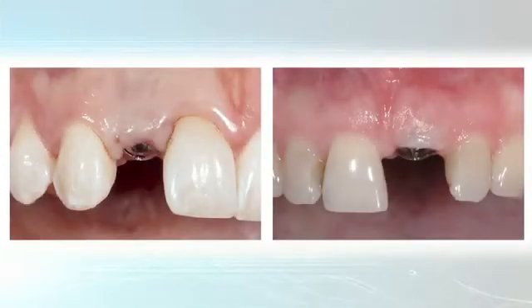But in many cases where a tooth was taken out and implant placement delayed, or for example a congenitally missing tooth where orthodontics opened up a space and now the surgeon placed the implant, covered it back up most likely, performs perhaps some soft tissue augmentation, it's very common for the restorative dentist to get the case back looking like the two examples you see on the screen.